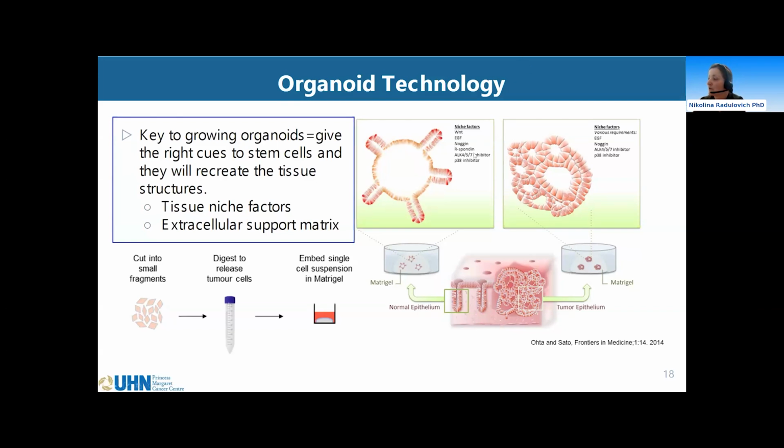These structures look like tissues. Practically, the way it works, we take the tissues from the patient. You can take the normal tissue and the tumor tissue, cut them up in little bits and pieces, and use some type of collagenase to digest away the collagens and connective tissues, leaving the tumor cells or the normal cells intact.